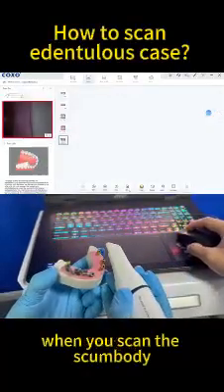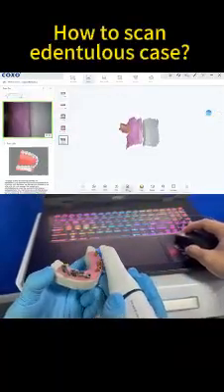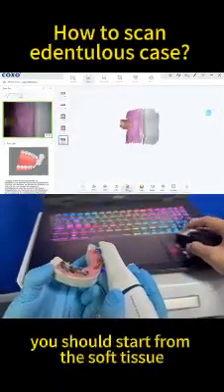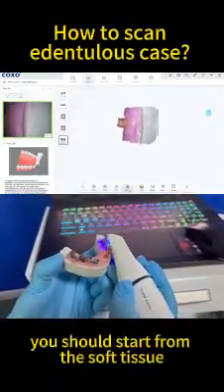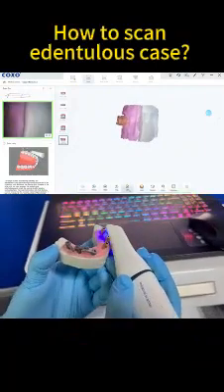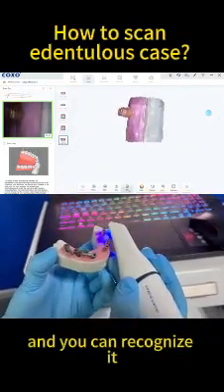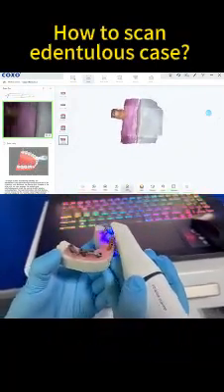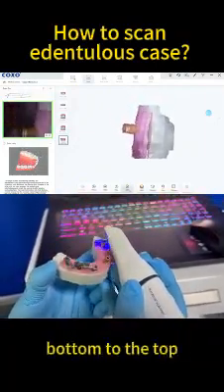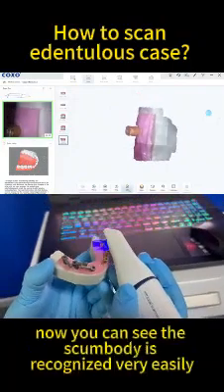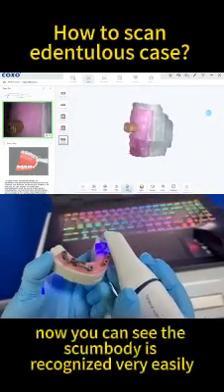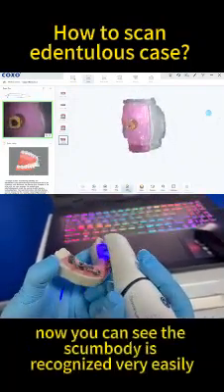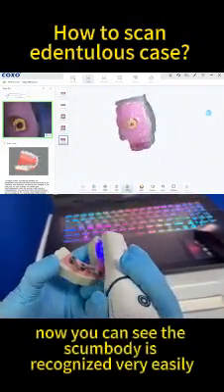When you scan the scan body, you should start from the soft tissue so you can recognize it, then move from the bottom to the top. Now you can see the scan body is recognized very easily.